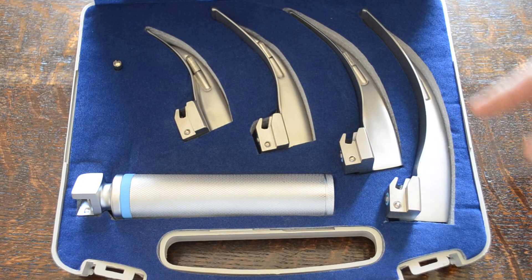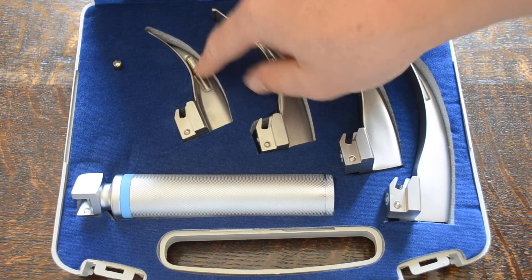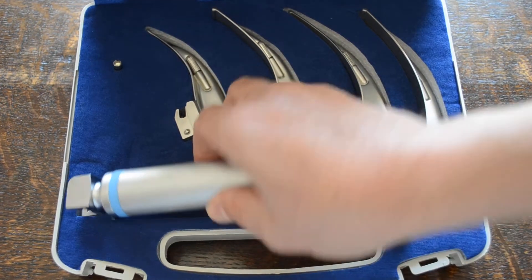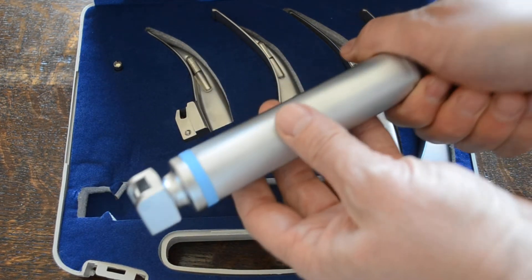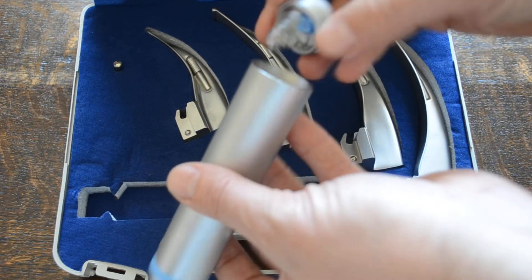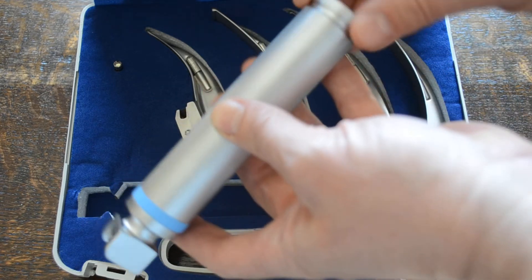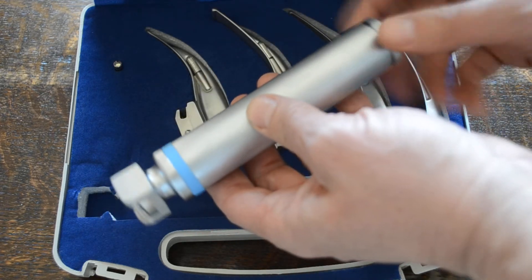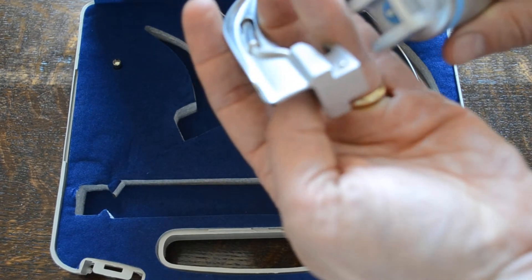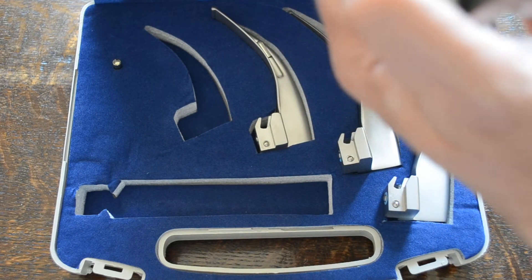Each of the four blades has a direct bulb illumination built into it. There is a spare bulb supplied with the pack, and it comes with a standard handle battery pack. It's a quality turned steel battery encasement that takes two standard C size batteries, and the handle is a standard clip attachment with lock.